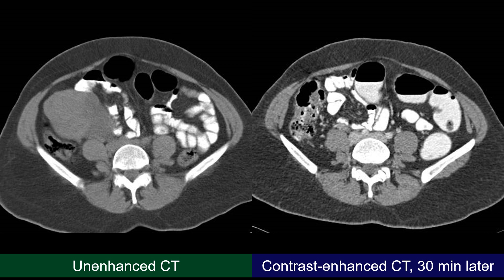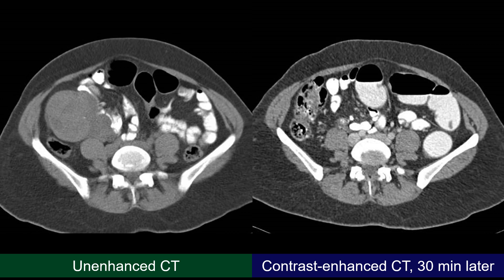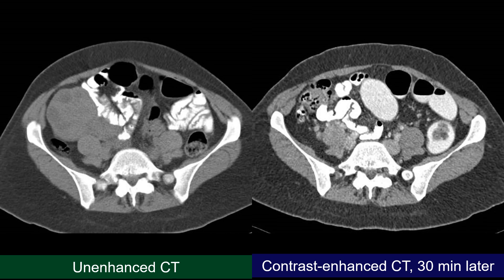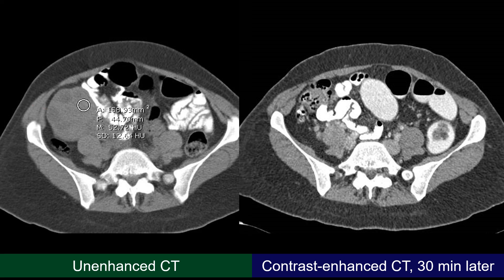On the unenhanced CT we see a solid lesion which is not identified on the contrast-enhanced CT. It has a tiny spot of calcification and a few peripherally located rounded structures less dense than the rest of the lesion. The rest of the lesion is quite dense for what we expect from a soft tissue lesion on unenhanced CT.